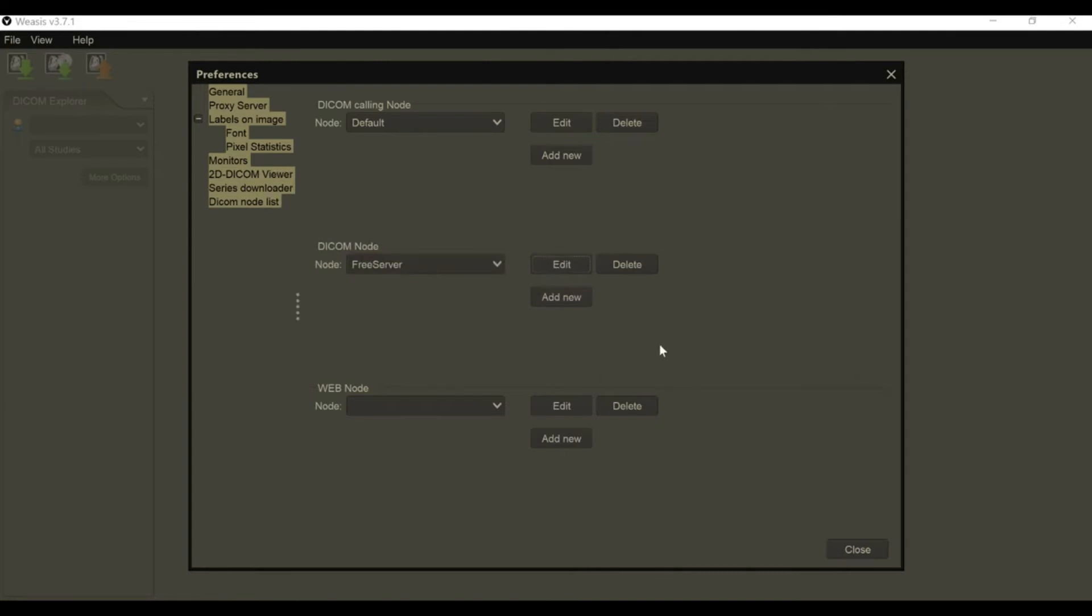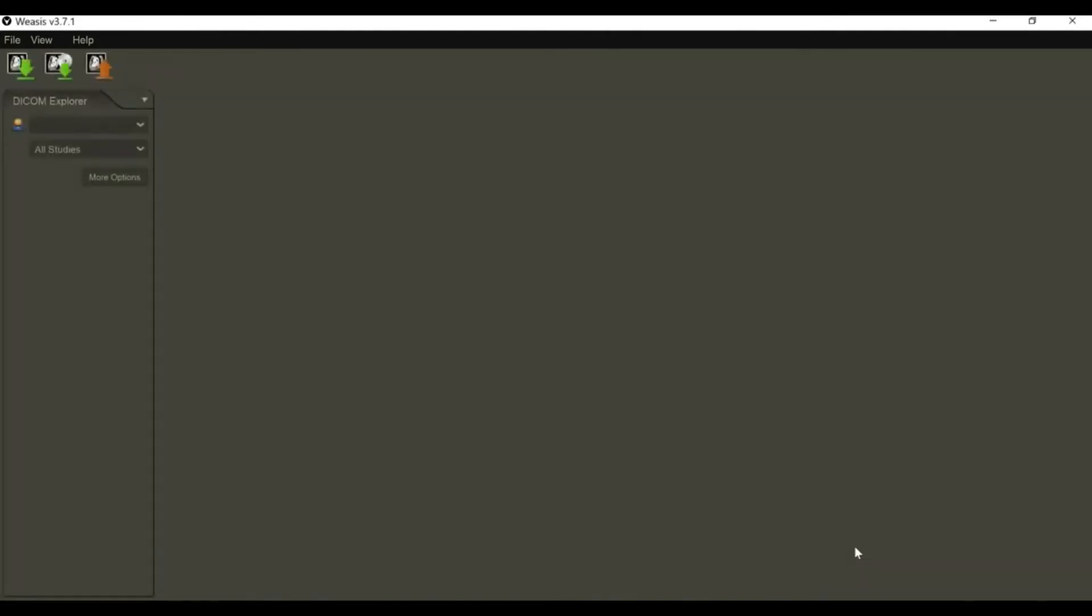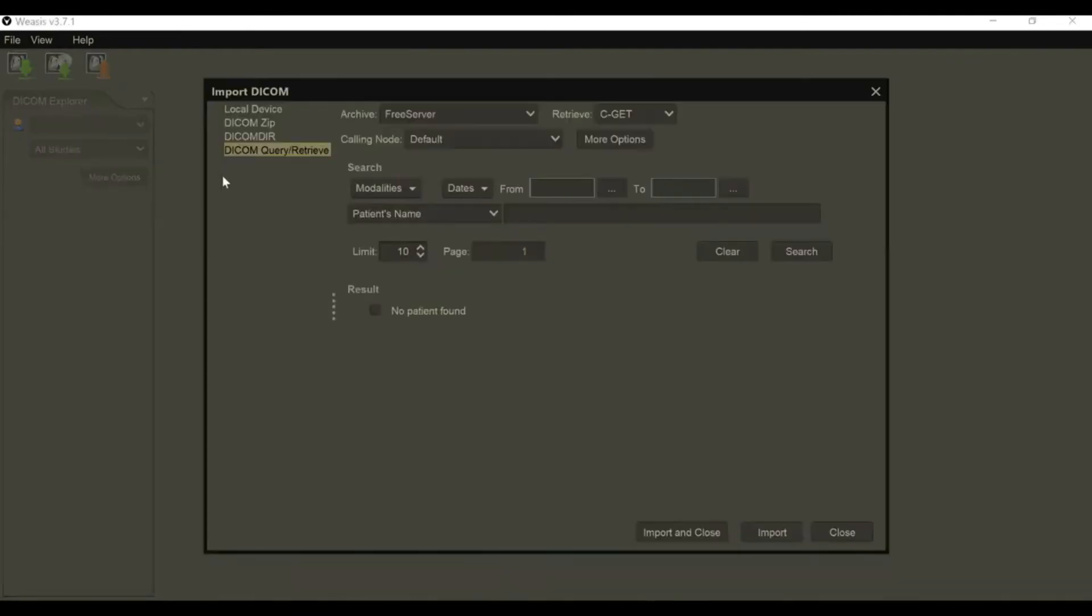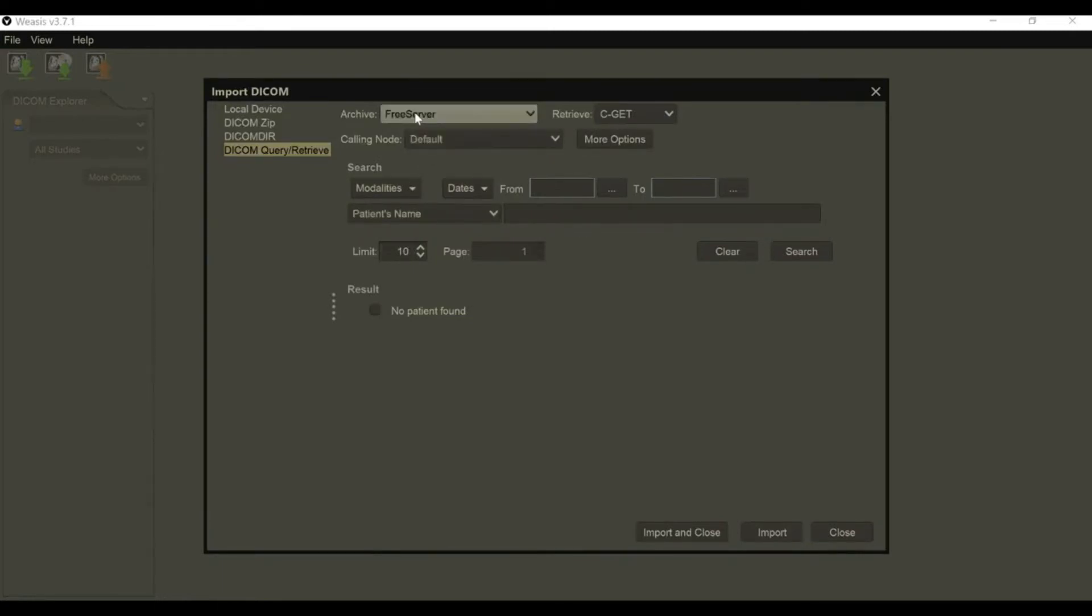You can close that, and you're just going to go to this Download Import DICOM button. It's populated by our free server, which we configured.